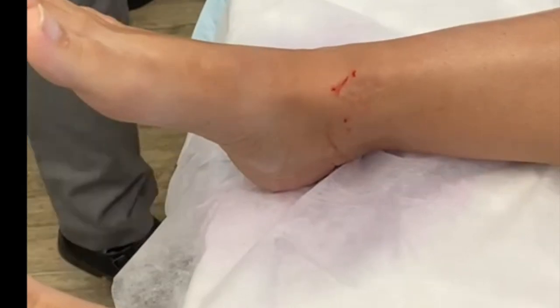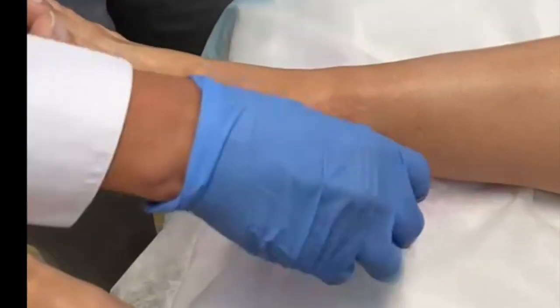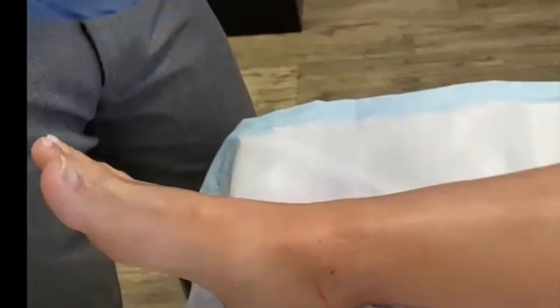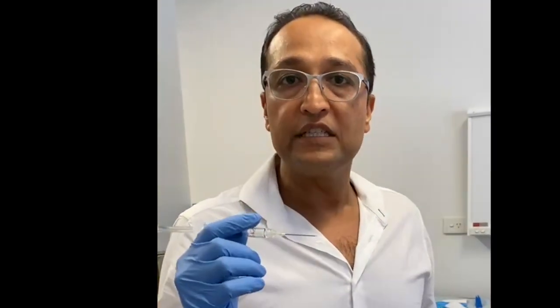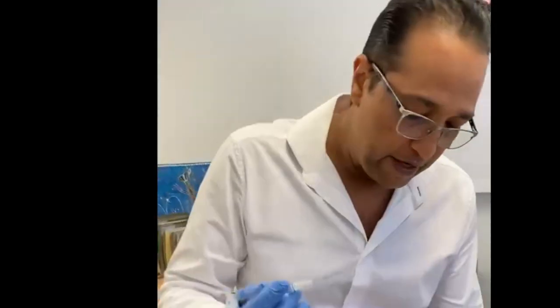The local anesthetic is numbing the area. I'm inserting Durolane, which is a synthetic hyaluronic acid, for ankle arthritis. This lady had an OCD lesion with an OATs procedure done, and now has degeneration. The definitive options would be ankle replacement or ankle fusion, but she's 43 years of age, so we're trying something conservative before going to that phase.